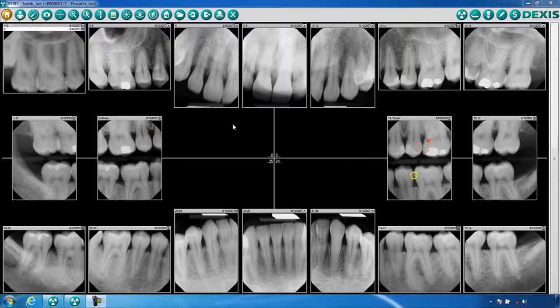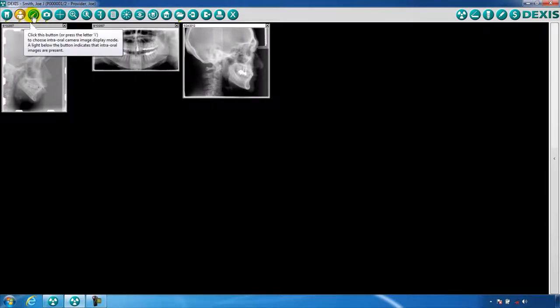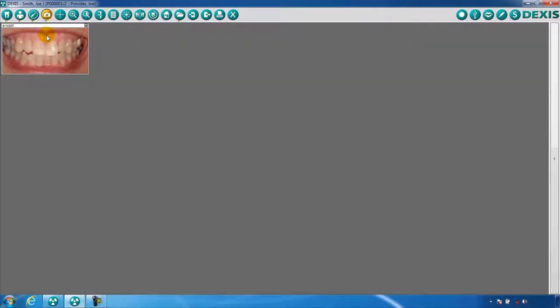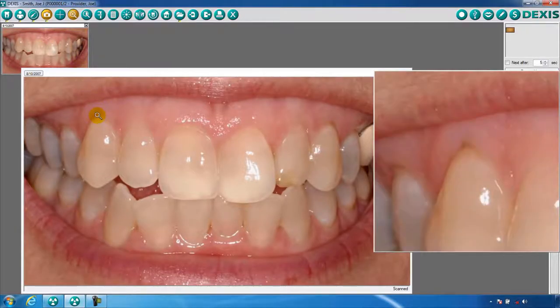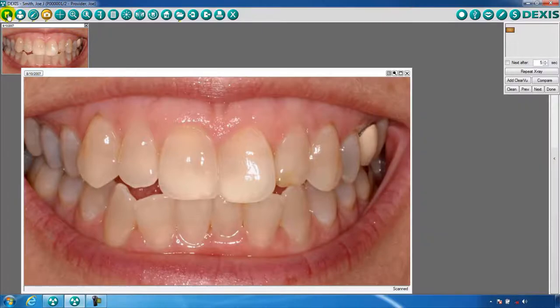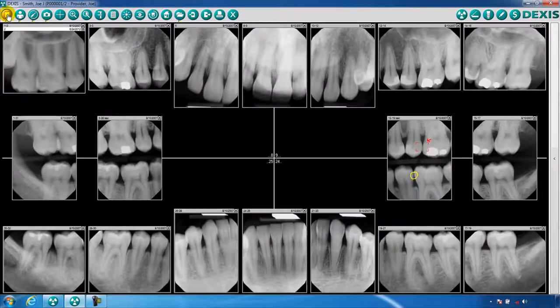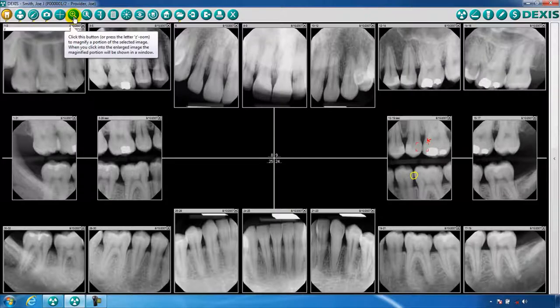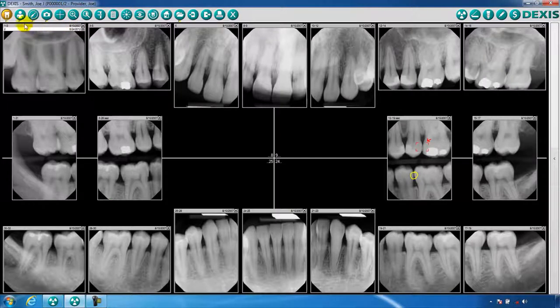The DEXIS toolbar contains icons that, when clicked upon, will open the corresponding module or perform the corresponding task. When you hover the mouse cursor over any icon, a tooltip bubble will appear describing the icon's function.